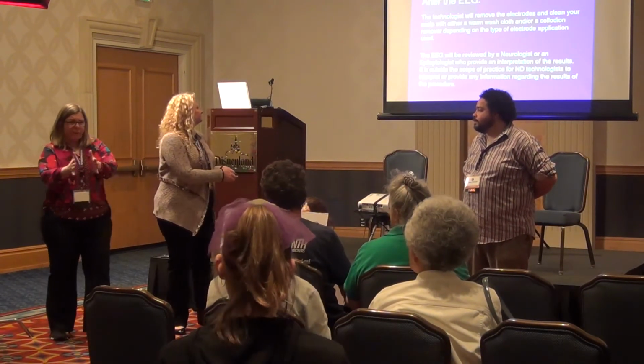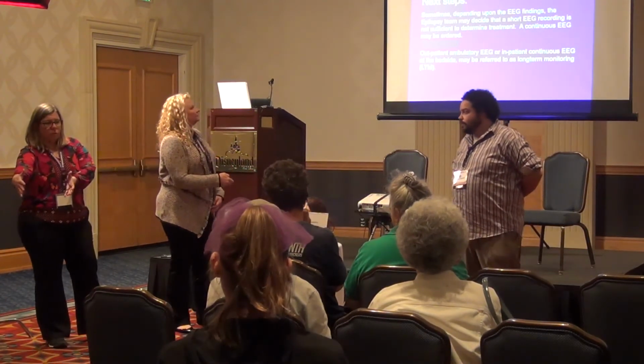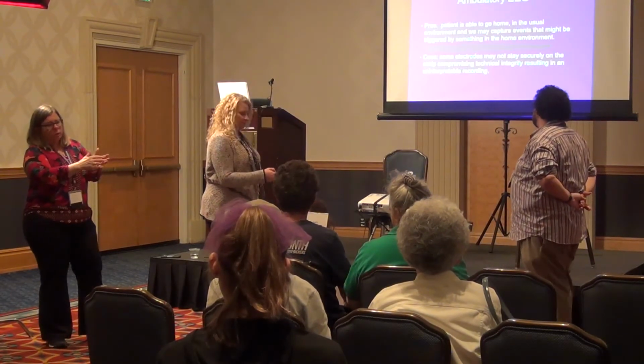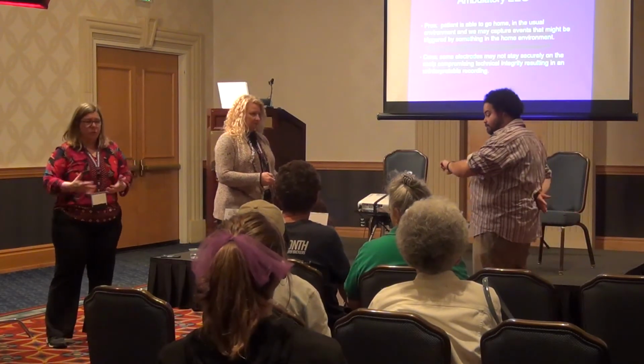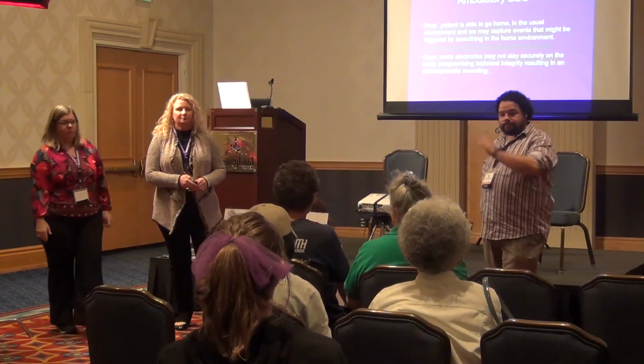In other words, you don't have to have a seizure during an EEG to determine that a person has a seizure disorder. Sometimes the brain will put off these little waveforms that aren't a seizure, but that tell the physicians that this person has a seizure disorder without actually having a seizure. Are those called spikes?